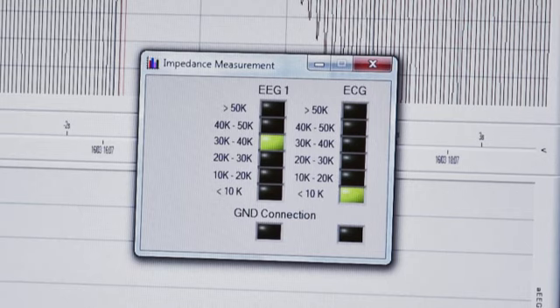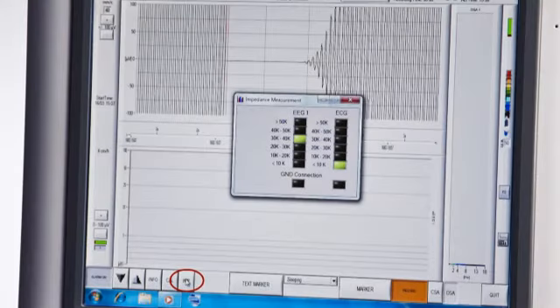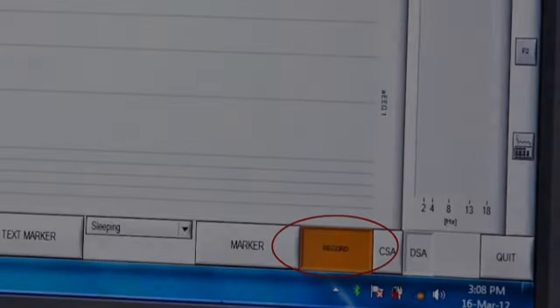The traffic light system will advise you of the impedance range for the electrodes and your ground electrode. Green indicates good impedance, red indicates poor impedance. To stop the impedance check, click the IMP button at any time.